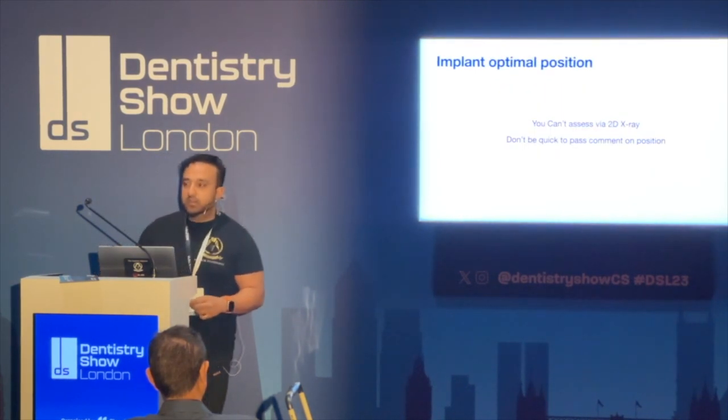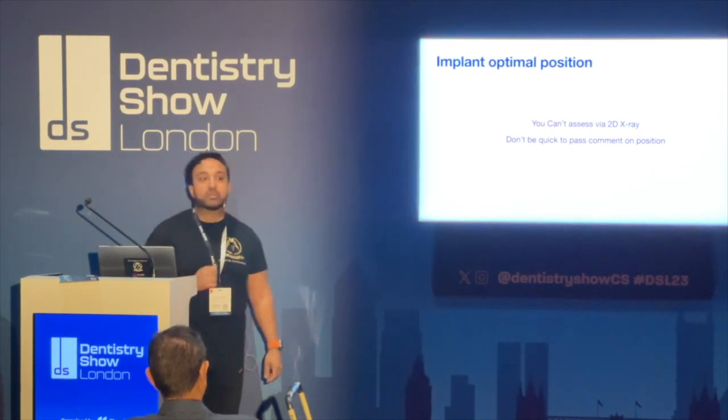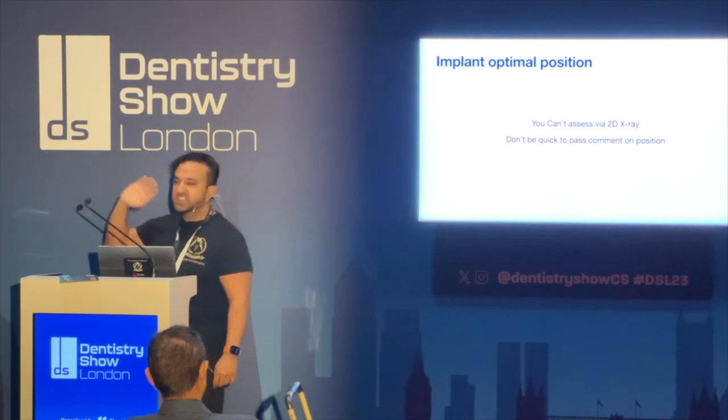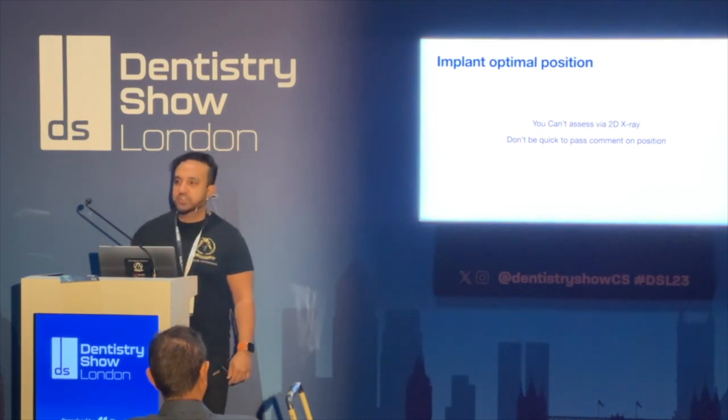The next topic is really about understanding implant positions, okay? And I'll give you a story. I had a referral back from one of my patients that I placed implants for back in 2009. Hadn't seen me for years and years, comes into my clinic and goes, Avik, my dentist told me you've placed the implants in the wrong position. I'm like, right, yes, so you sort it out. Now, this was many years down the line.